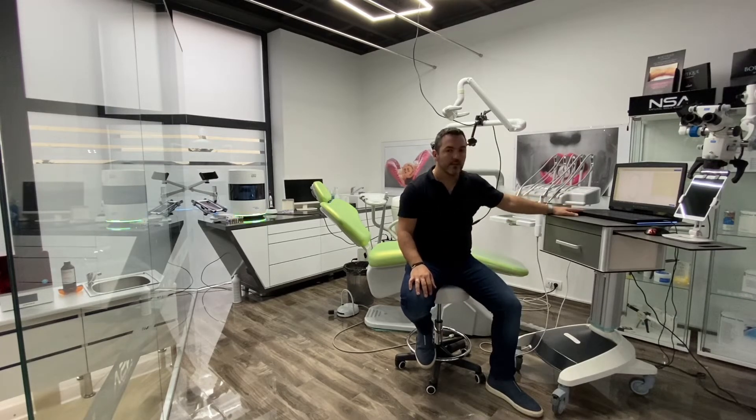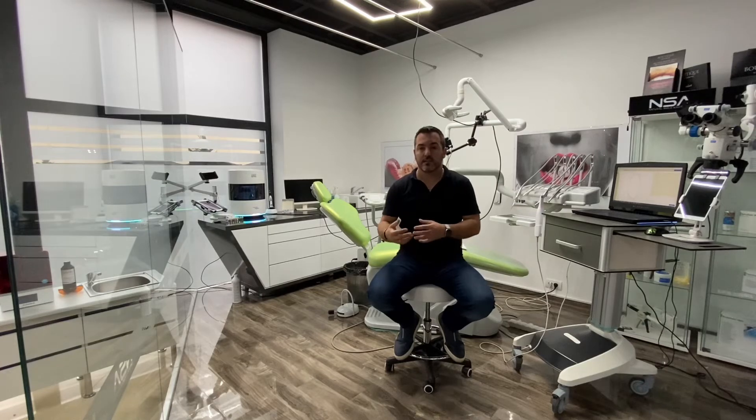Once we have the new design, the next step is to have a chairside printer in the office — you can see it in the corner to my right. A chairside printer is a very small printer that works really fast and can print very good quality veneers for mock-up. When we have a patient and want to show them how their smile planning should look, we scan the patient, design everything, print individual veneers, and place them in the patient's mouth — or print them all in one piece. Then we take photos to show the patient how they can look before we start any preps.